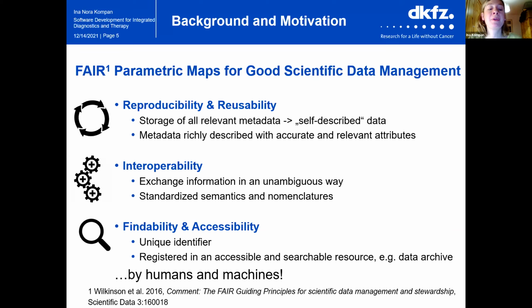So these FAIR principles should apply to humans handling the data. However, in times of rapidly increasing importance of data mining and machine learning, these FAIR principles should also apply to machines handling the data. I would like to present to you now a format which fulfills these FAIR criteria, being DICOM parametric maps.